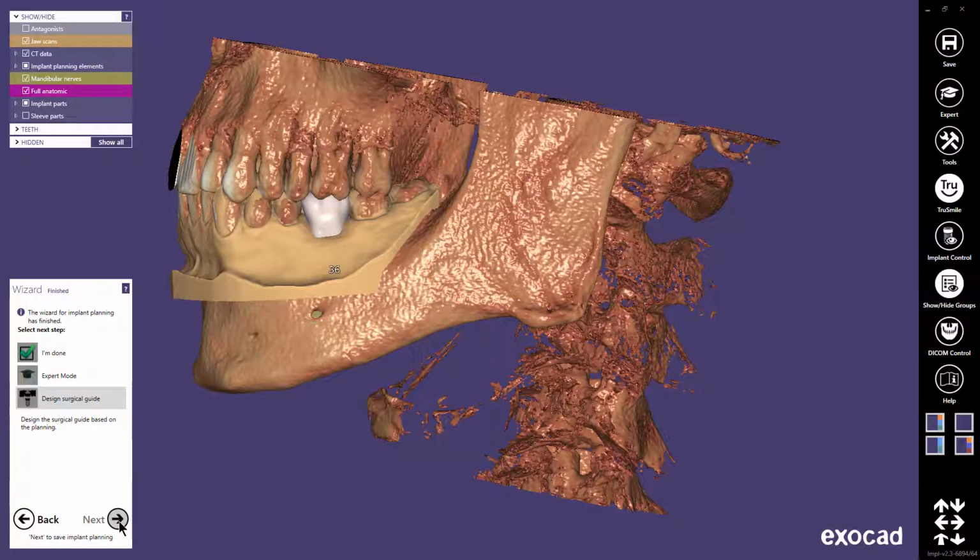Please note that manufactured surgical guides for endosseous dental implant placement are classified as medical devices by the FDA. Version 2.3 and earlier versions are not to be used for edentulous patients or patients with insufficient dentition that do not allow a stable fit of a tooth-retained surgical guide.